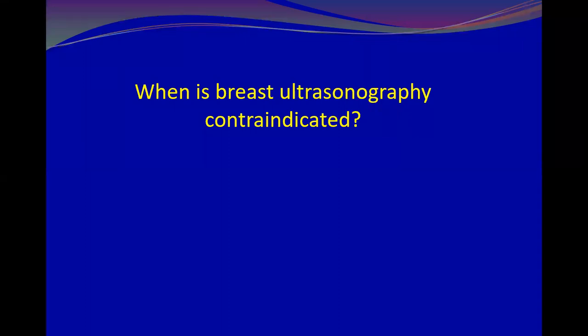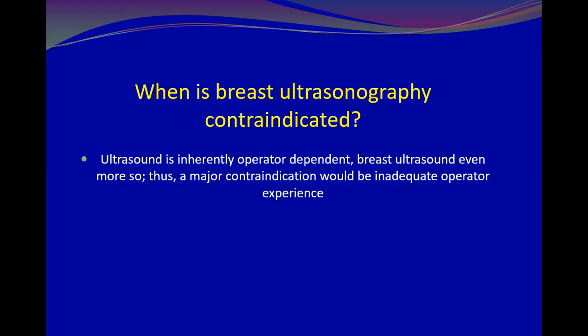When is breast ultrasound contraindicated? Any contraindication for ultrasound? In case the skin overlying the breast is extremely ulcerated? No, we have done a lot of ultrasound. In case of fungating tumors, or inflammatory processes? In fungating tumors, we have done a lot of cases with ultrasound. According to the previous examples, could you imagine when ultrasound is contraindicated? No contraindication.